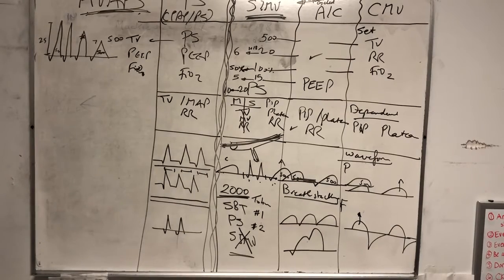You just set it and forget it. You don't need intensivists. And if you can invent an arm that goes in and pulls the endotracheal tube, then you're golden. You don't need anybody. But see, that's the mode of ventilation.